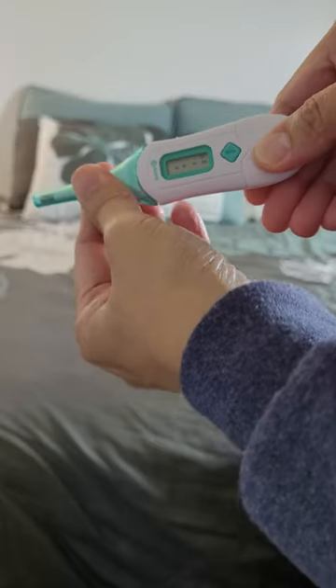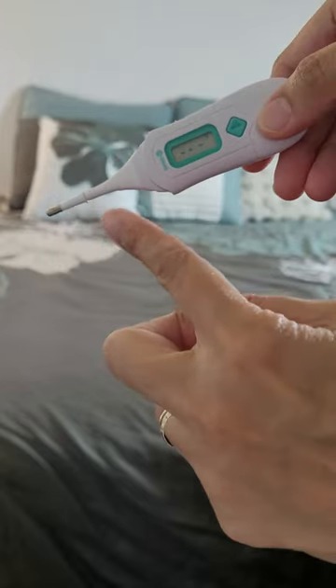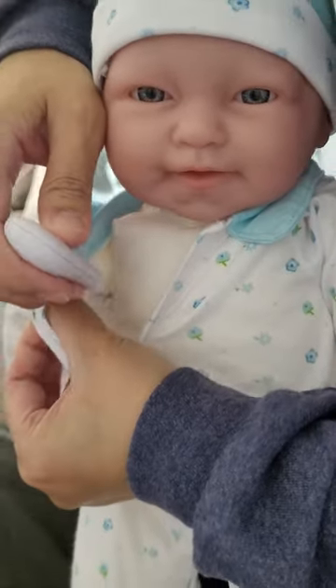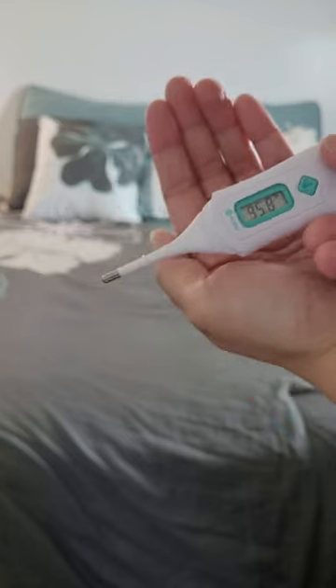Then, take the thermometer out of the container and turn it on. Lift one of your baby's arms. Place the silver tip of the thermometer under the arm and make sure you have it in the middle. Hold your baby's arm as close to his side as possible. Wait for a few seconds until you hear the beep.